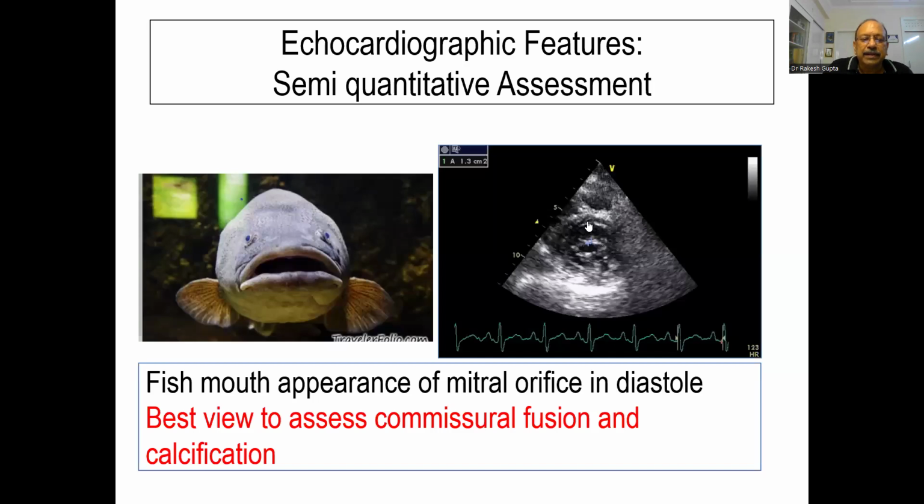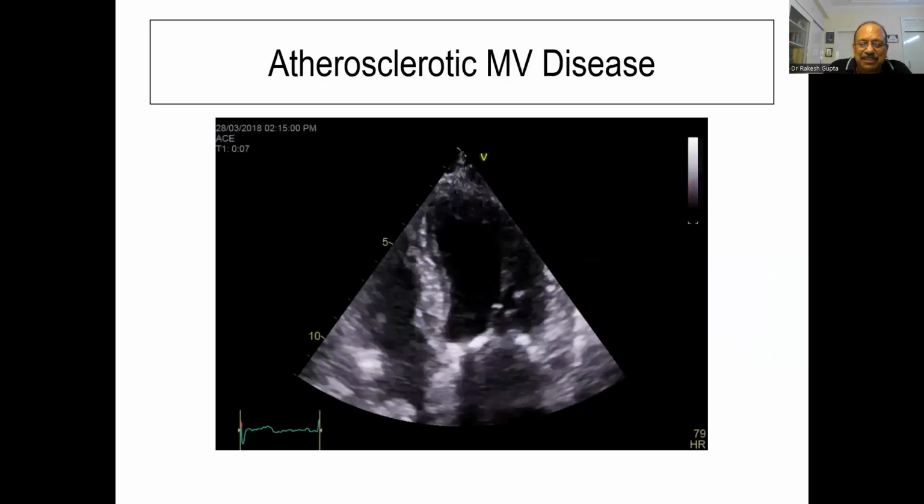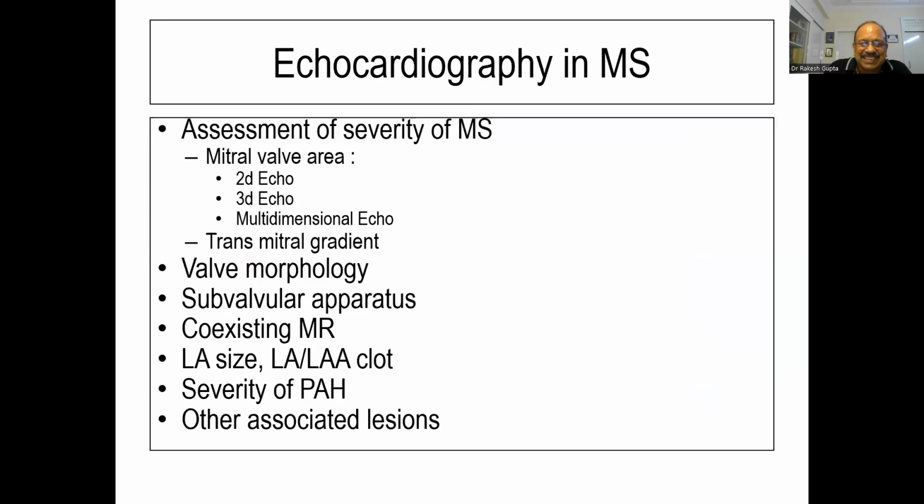Dr. Tanmay Roy? Sir, is there any role of M-mode measurement to look at the etiology of mitral stenosis or at the degree? Tanmay, you are asking me in the era of 2024 about driving a Maruti car. There are so many things available. When a battery car is available, why do you want to go and buy a Maruti 800 now? Okay, sir, you just mentioned the EF slope. I did mention it because I knew that someone like you would ask me this question.